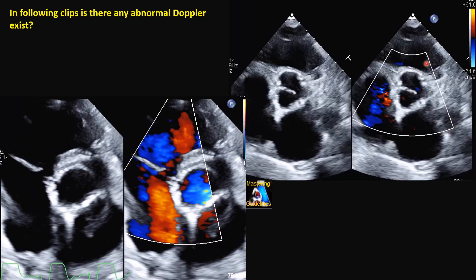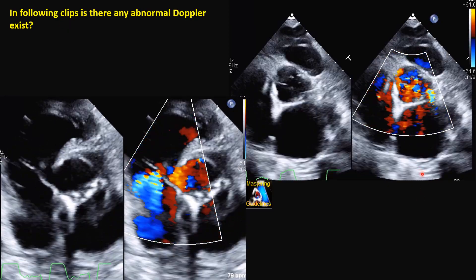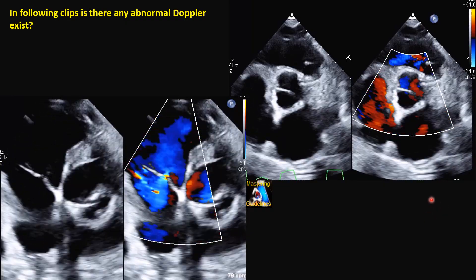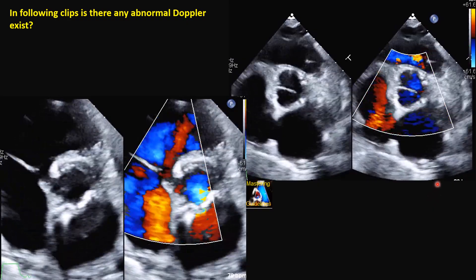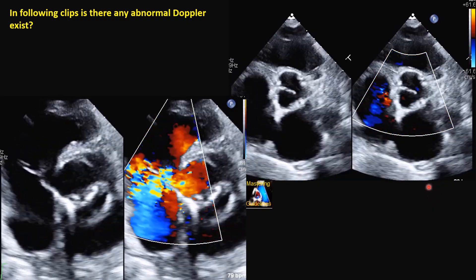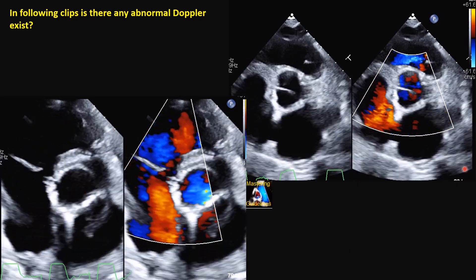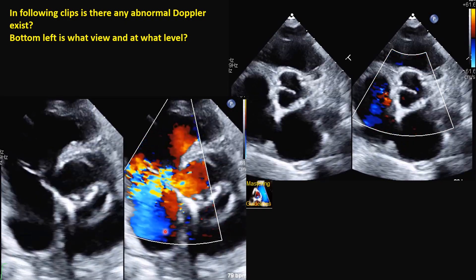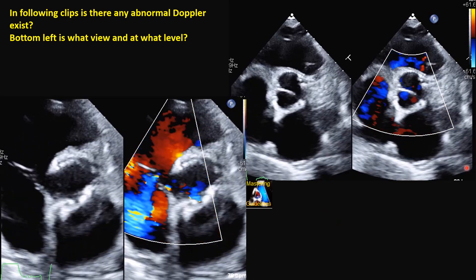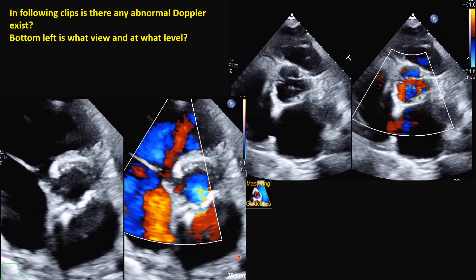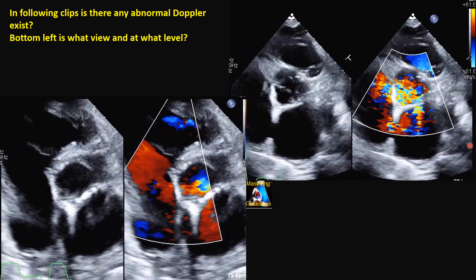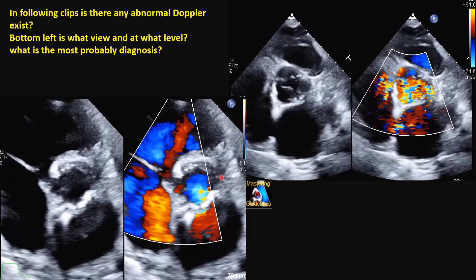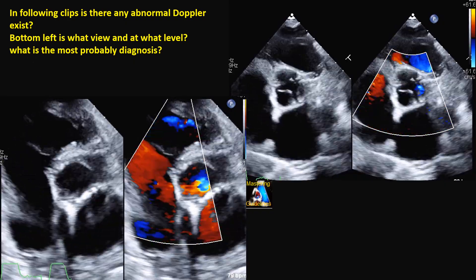Here we have another case. On the right side you see a color Doppler. What type of abnormal color Doppler do you see? Name all of them and identify what they belong to. Second, this view — at what level has it been taken? What view is that and at what level? What is the most important abnormal finding you can see here? And what is the most probable diagnosis for this patient? Both images belong to the same patient.